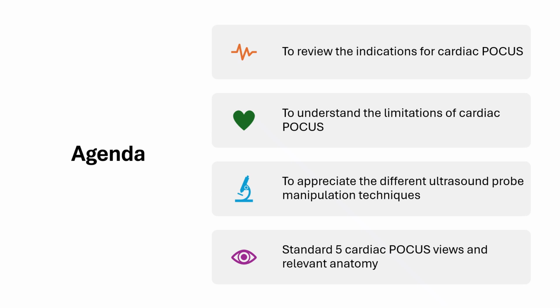The agenda for today's presentation is to review the indications for cardiac point-of-care ultrasound, to understand its limitations, to appreciate the different ultrasound probe maneuvers and manipulation techniques, and also learn about the standard 5 cardiac POCUS views with relevant anatomy.